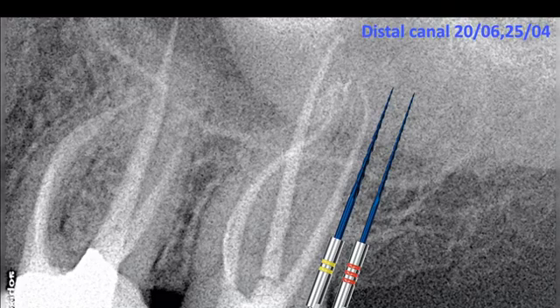But I don't use the 2506 because it has too much taper. I use the 2504 because I want to have a small taper according to diameter, because I also have a small curvature in the apical part of the tooth.